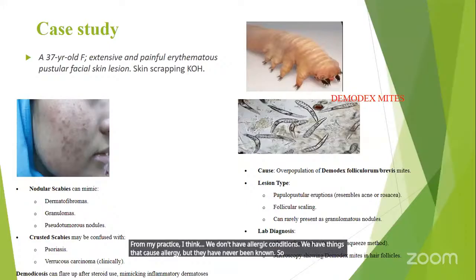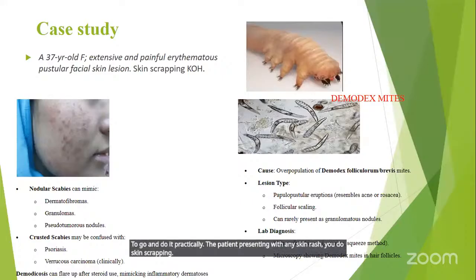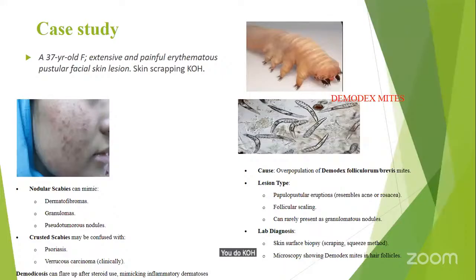So I want you from today to go and do it practically. A patient presenting with any skin rash, you do skin scraping, you do KOH, then you give it time to digest for like 2 days. You centrifuge, check your deposit, and you'll find these things that I'm talking about.